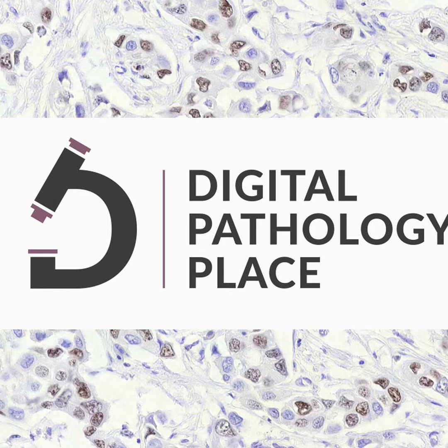Also, digital pathology can infer microsatellite instability from routine H&E slides and prioritize confirmatory testing. So this is molecular prediction from H&E, a big thing, and then you just do confirmatory testing. And also we have CT and MRI, so we have radiology segmentation, radiomics-based risk stratification, nodal staging, and response prediction.